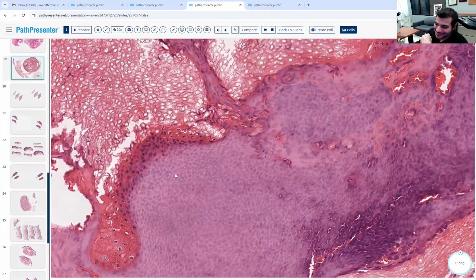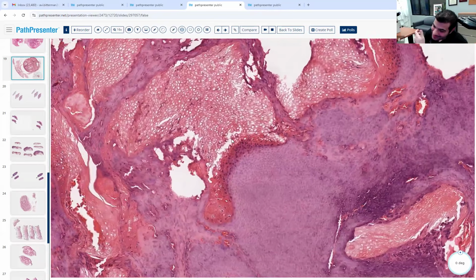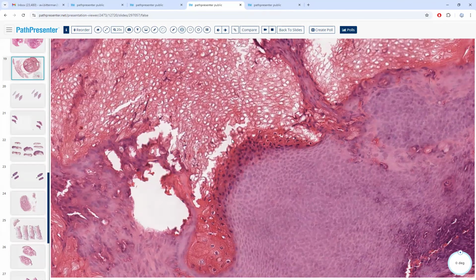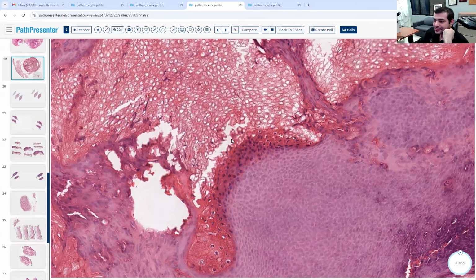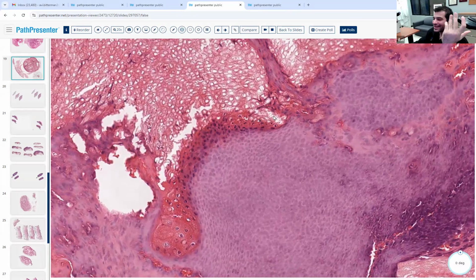There's only one. It's this one, pilomatricoma, or pilomatrical differentiation. What are some of the conditions associated with pilomatricoma, by the way? Rubinstein-Taybi. Rubinstein-Taybi, okay. What else? Gardner syndrome. Turner syndrome. Turner, Rubinstein-Taybi. One more. Is it myotonic dystrophy? Good. Myotonic dystrophy.